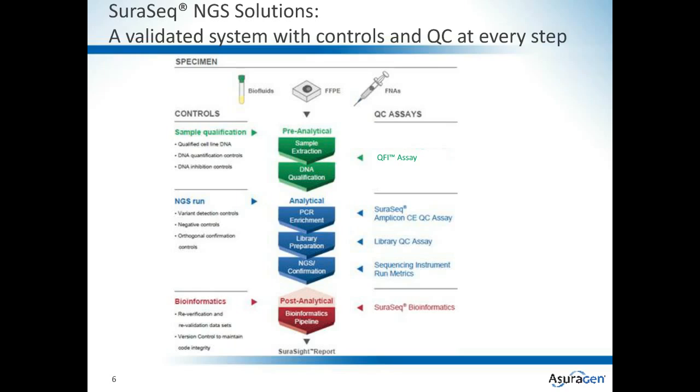At the analytical phase, we typically use a range of different enrichment technologies based on PCR, but I think the key point is that we've developed these technologies to accommodate the worst possible scenario of sample, so that once we've built these assays, they can be applied to FFPE or even biofluid specimens. And then ultimately the bioinformatics is to consider all of this information, including the noise that is intrinsic within a given clinical sample, to be able to make the right interpretation.